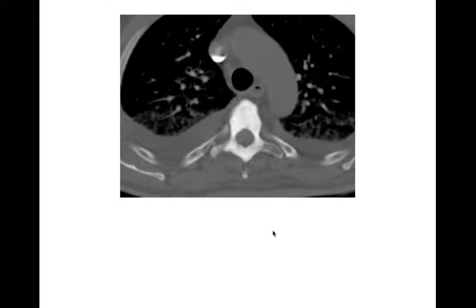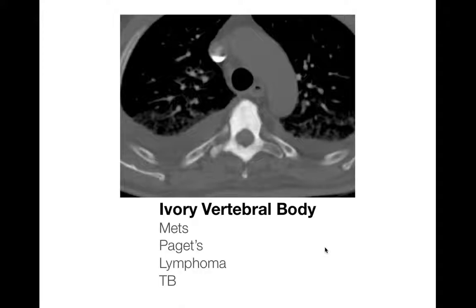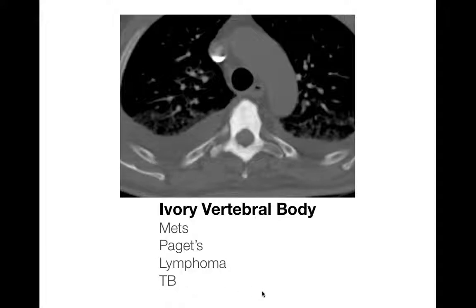Here's a classic differential for a very dense vertebral body — what we call an ivory vertebral body. Things to think about: metastasis is super common; lymphoma is fairly common. Paget's disease will also give you an ivory vertebral body, but one distinguishing feature is that Paget's tends to expand the vertebral body — look for that expansion, as it pushes you toward Paget's. TB or an indolent slow-growing infection can also cause this appearance.